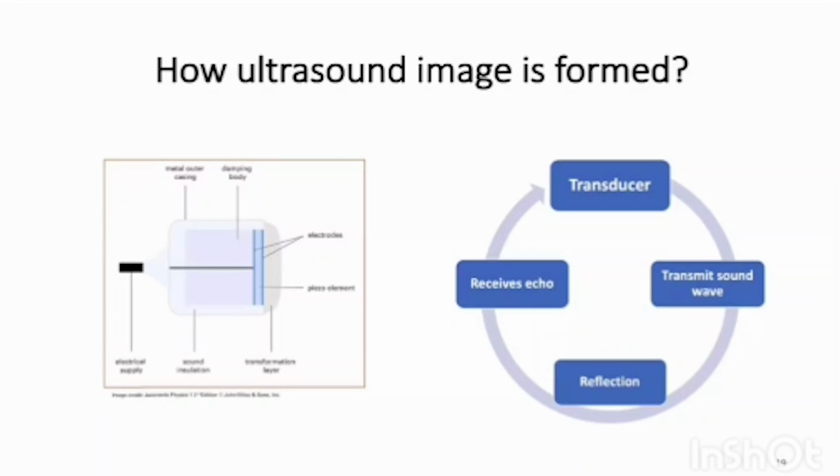Okay, this slide. So the sound wave is produced by the agitation of the PZ crystal, or the piezoelectric crystals. There is an important property of the piezoelectric crystal. When a sound wave is produced by one single crystal, until and unless it is reflected back to that crystal, no new wave is produced by that particular crystal.